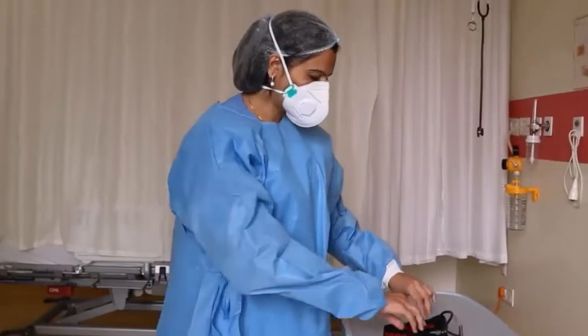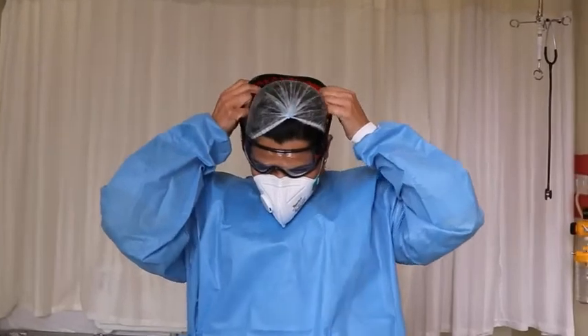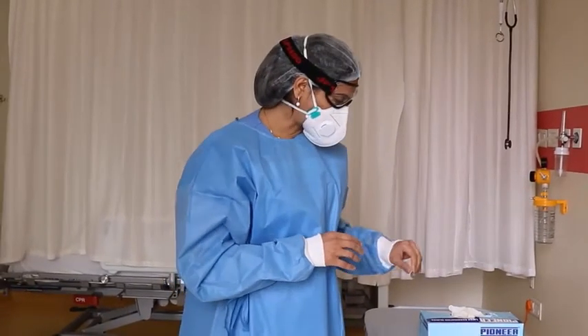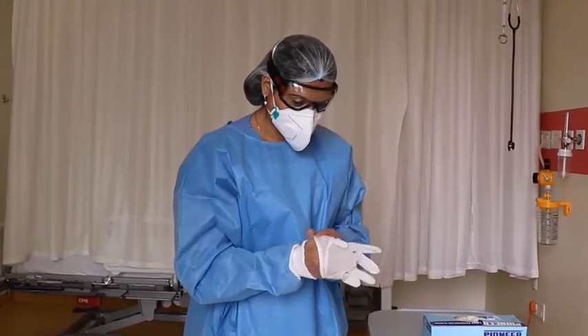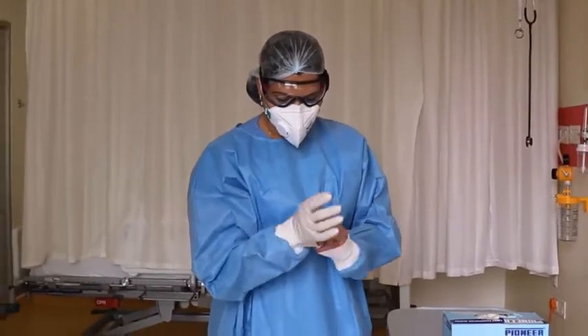Now we have to wear goggles over the mask. After wearing goggles, we need to wear gloves over the gown to complete the PPE wearing process.